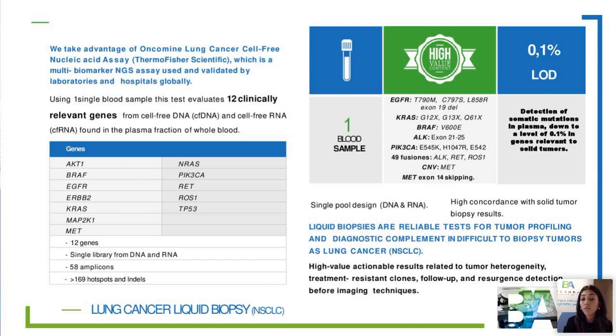I just want to mention, for example, that we have an extensive coverage of the EGFR gene, where we will be able to assay deletions on exon 19 and other types of mutations that we know show that the patient is going to be sensitive to these TKI inhibitors. But we also check for mutations that provide resistance against this treatment. So we will be able to inform how to modify the treatment in the second line. But not only EGFR.